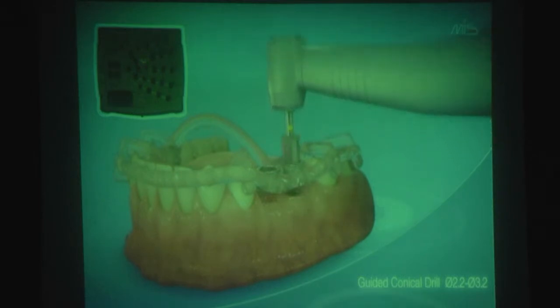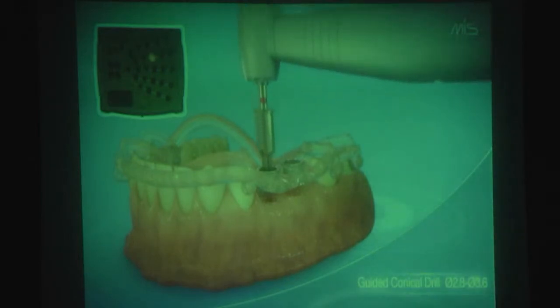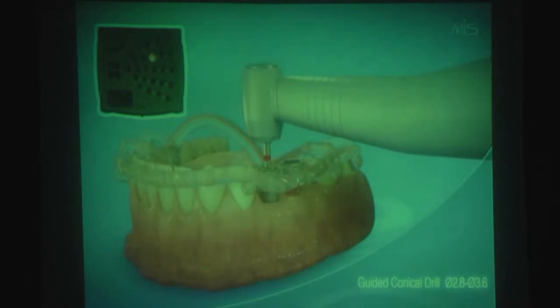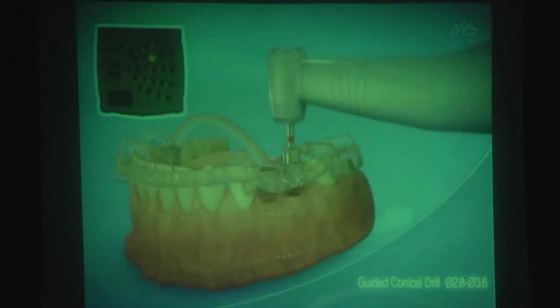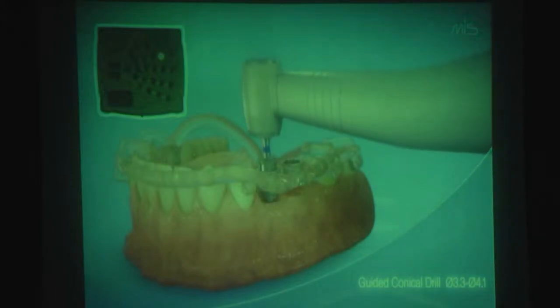Once we finish the osteotomy, no, this is the final drill, I'm sorry. Once we finish the osteotomy, we're going to take the guide out, and no, I'm sorry. We will place the implant inside the sleeve, and then everything will be over.